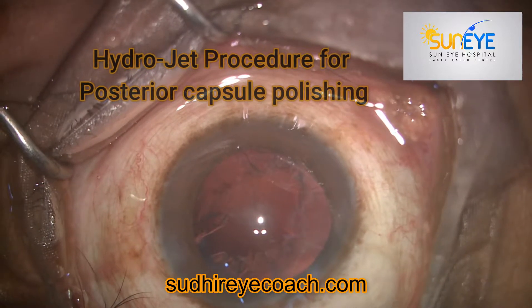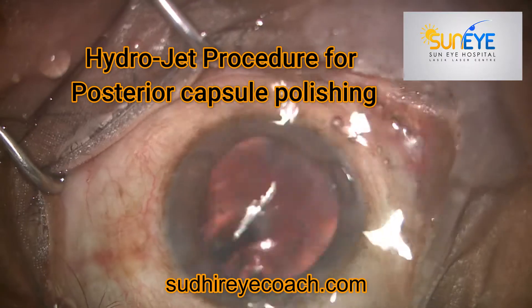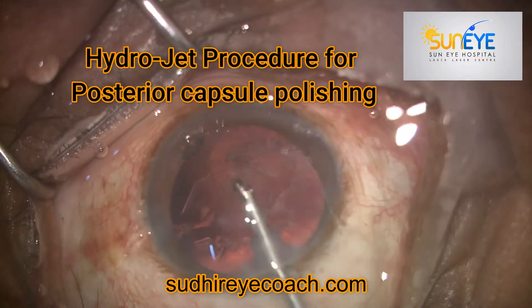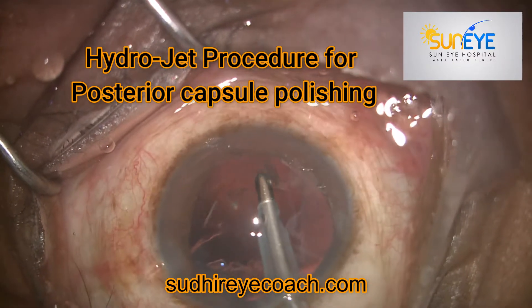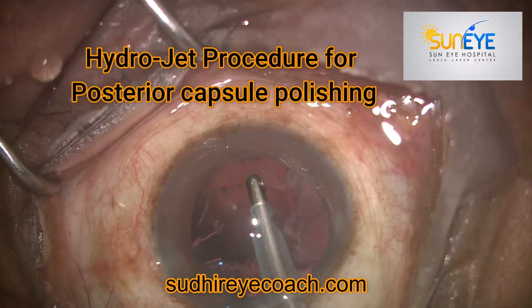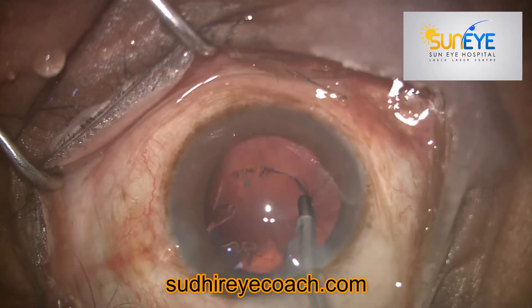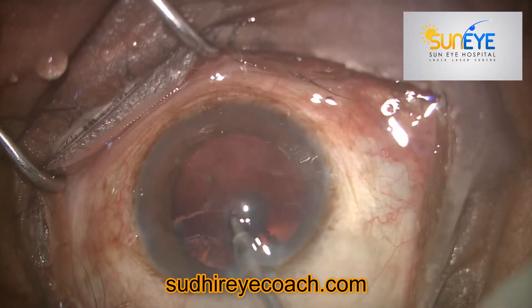Today I'll be showing a short video on the hydrojet procedure for posterior capsule polishing. There are several ways to polish the posterior capsule — you can use low vacuum settings during irrigation and aspiration with the I&A tip, or there are several tools available in the market.